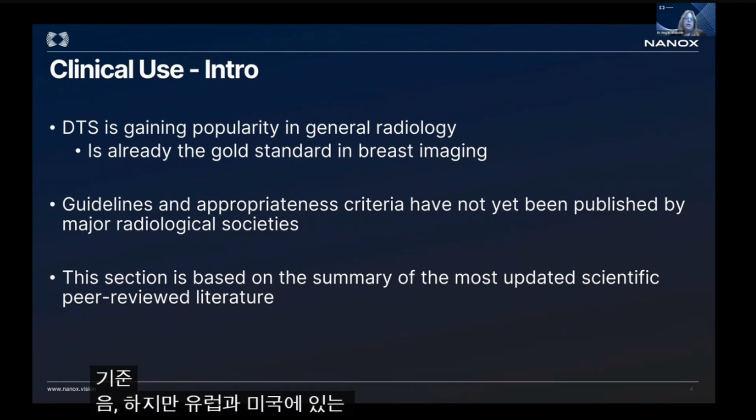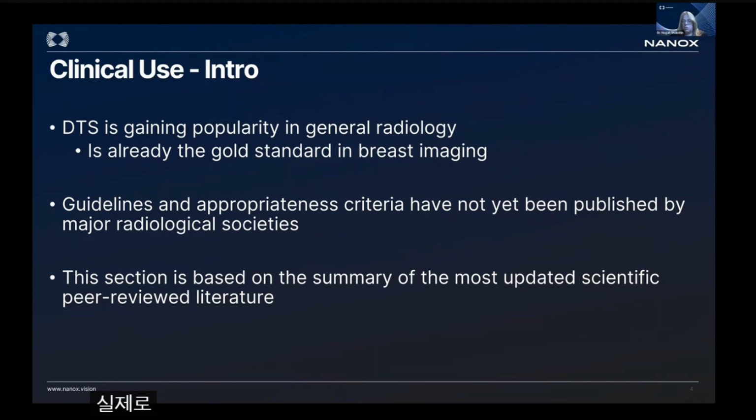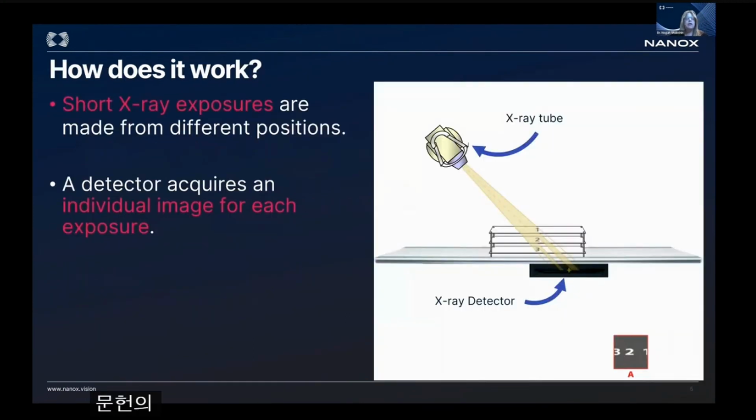But there are several FDA-approved machines that are standing in Europe and also in the US, and actually there are several also in Israel. They're starting to gain popularity, and you can see that by the number of publications in the literature.